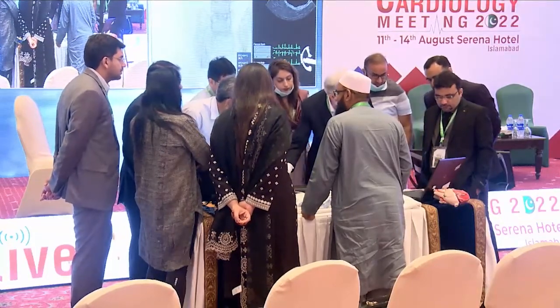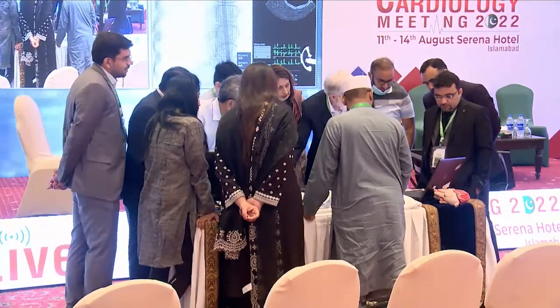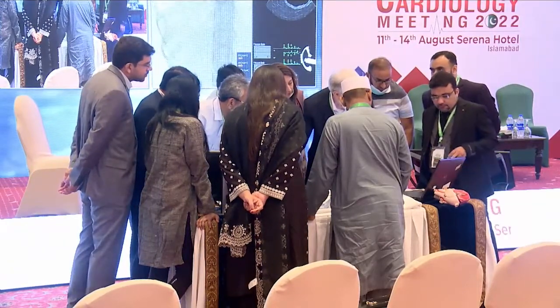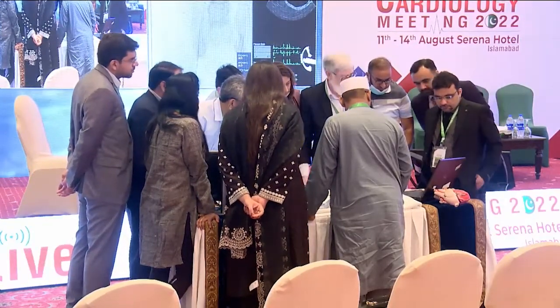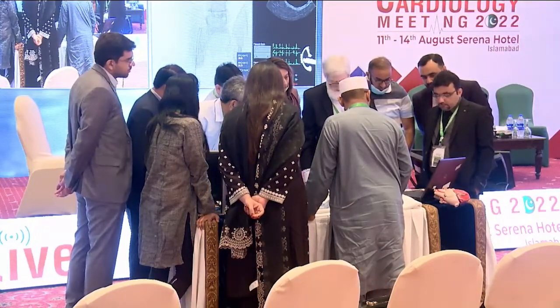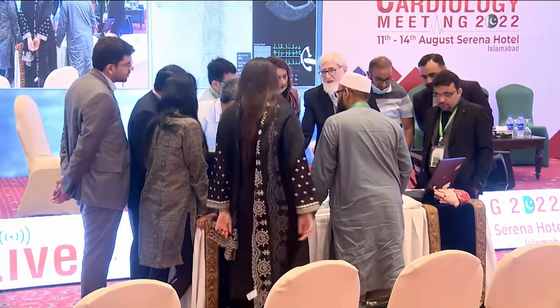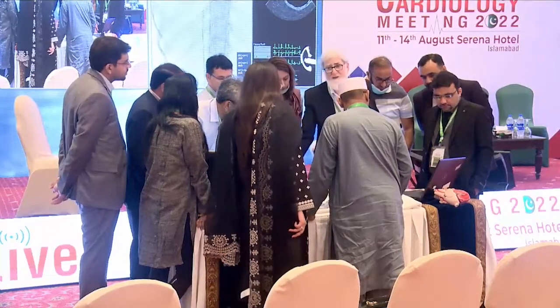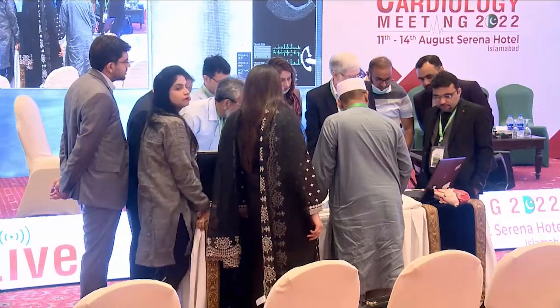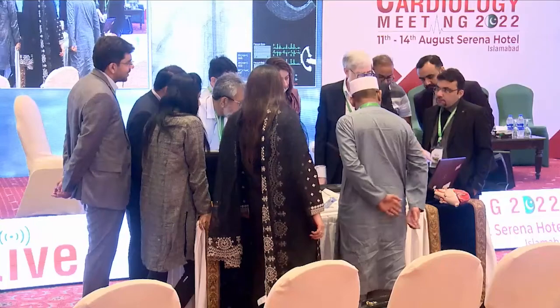You have gone up. Yes, I have already gone. Now push the wire. Now it will go automatically. Through the femoral access, with auto tracking, we are going. In the system there is auto tracking, and you can go manually with these buttons. You can auto track any tip which you are introducing. Okay, so now you are at the SVC.